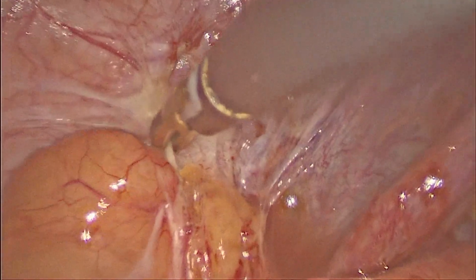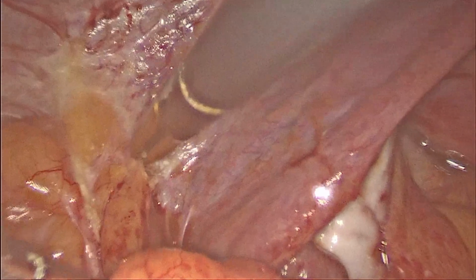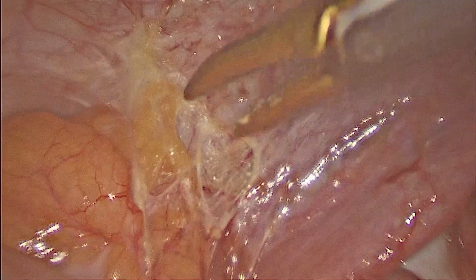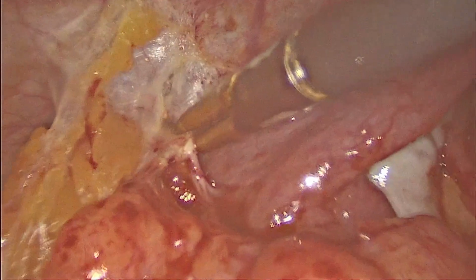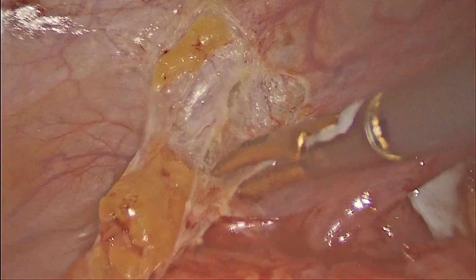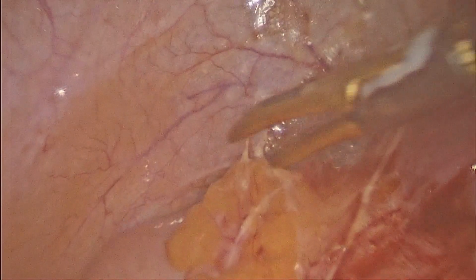If you have a good place between the important structures like intestine and lateral pelvic wall, then the bipolar shear is a good device. But if there are very dense adhesions, when we are dealing very close to these delicate structures, then it is better to go for a harmonic device, which has very little lateral spread and a good amount of hemostasis with very little smoke. So these are the major advantages of harmonic. Slowly we are separating the sigmoid colon adherent to the left side of the pelvic wall.